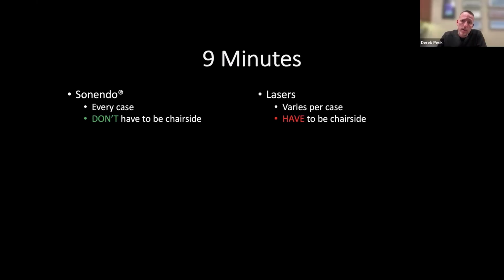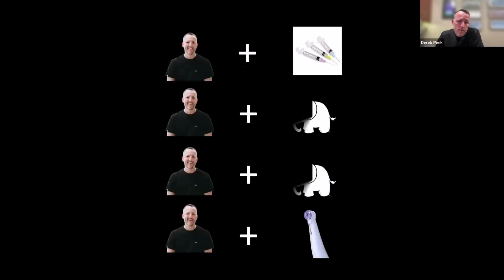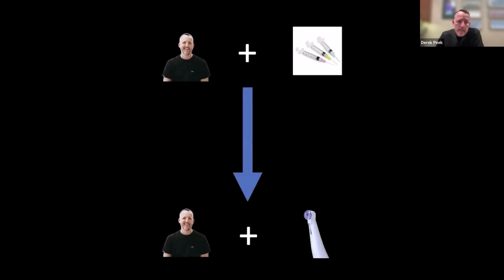We all work hard, and that was the other puzzle piece, finding little breaks throughout the day because we all need it. But with the laser, I really felt like it was mandatory four-handed dentistry all the way through. Somebody had to irrigate, somebody had to run the laser, all these things, and I was just doing the math and going through things. And maybe on a regular molar, it's going to be anywhere from 5 to 9 minutes. Okay, so same, same, same. But the thing that wasn't the same is I had to be there, versus GentleWave, I didn't have to be there. So that's how I worked through my process to get to where I am today.